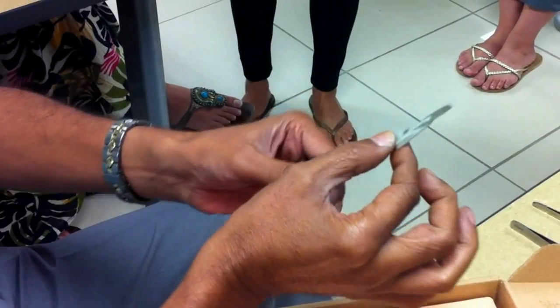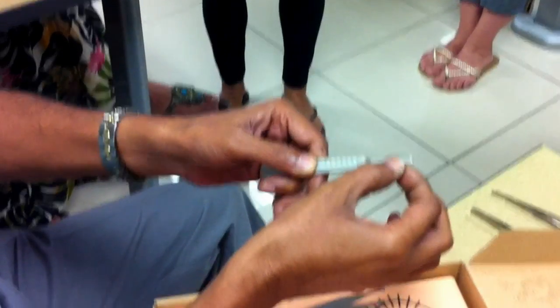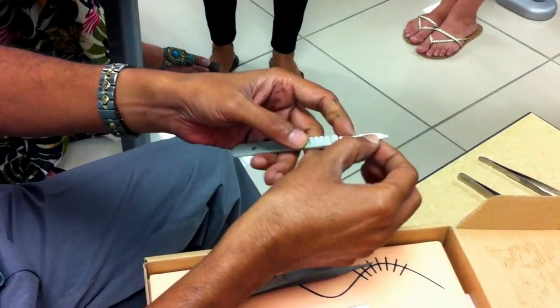Okay. This is the Bard-Parker blade and knife. This is the Bard-Parker handle, and these blades are supposed to be detachable. I don't know whether this one is detachable or not.